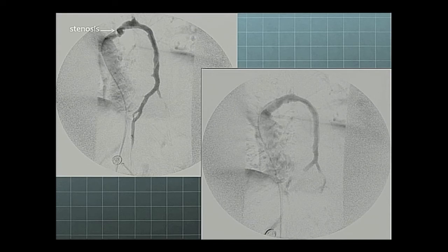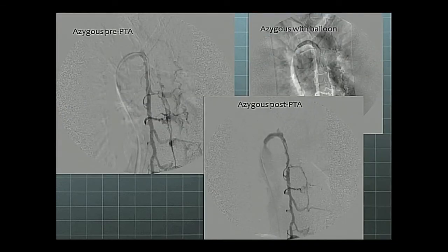Less reflux post-angioplasty. Another example, just beyond the arch, kind of a regular narrowed arch here. Very marked filling of collateral branches out to the point where we're almost getting tissue blushes.